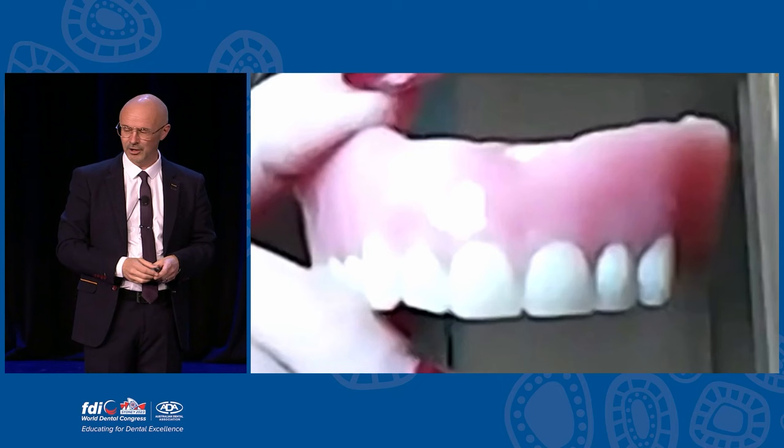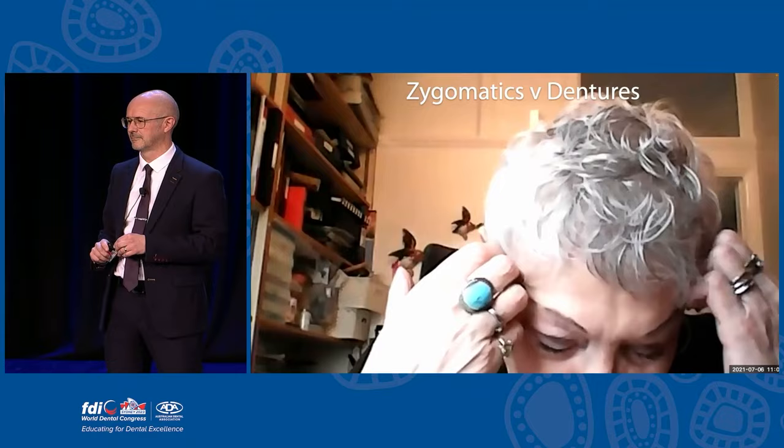I can use the records I have - this is her denture that she's wearing at the top, and I can immediately look at it and think we can improve on the aesthetics. I can have a good conversation with the patient. She's done her research and looked at zygomatic implants - she doesn't want that, but she doesn't want dentures either. She says nothing fits, and she gets really upset about it. She just wondered if I could help her.